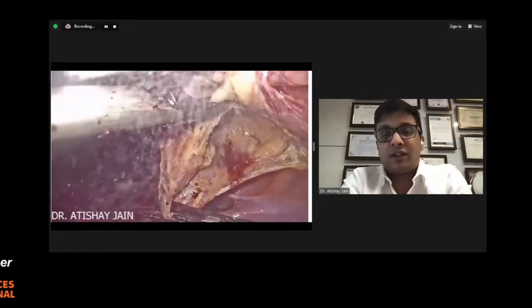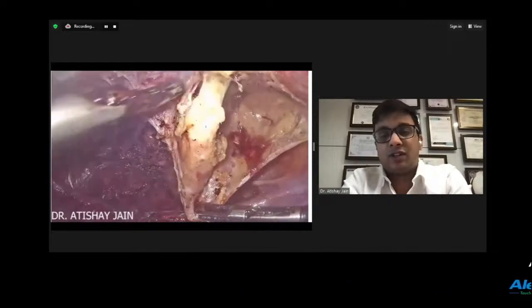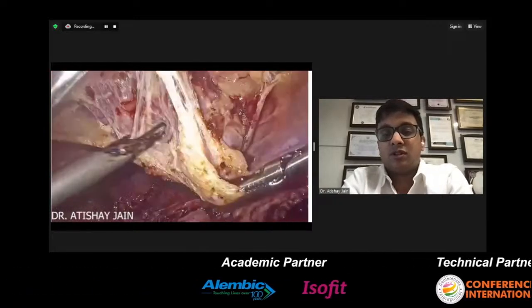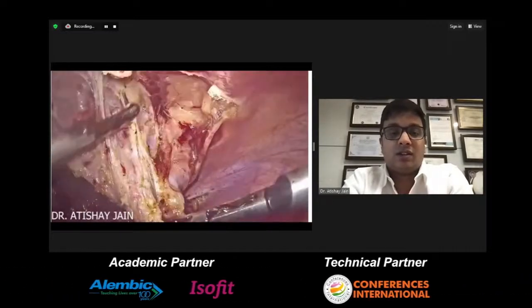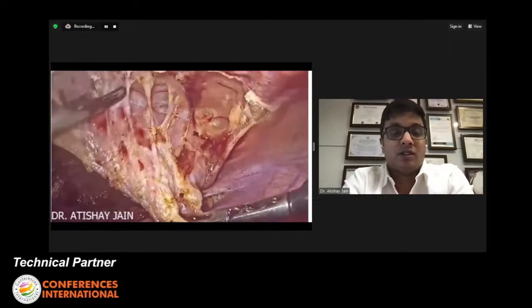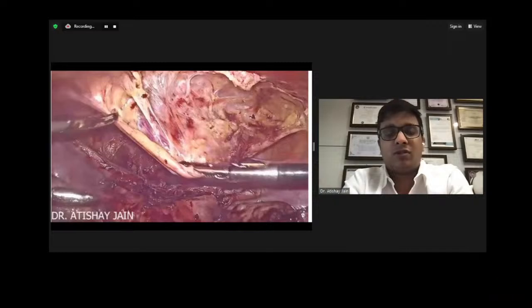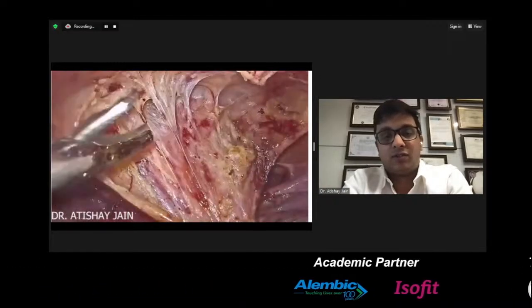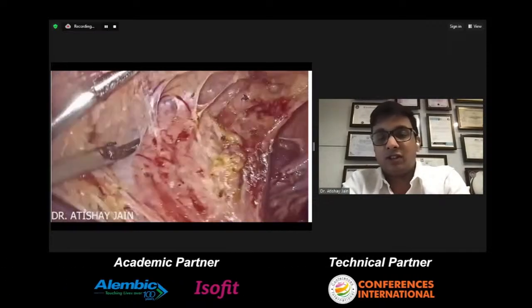Now the spaces are being created, and we've already filled up the bladder, so we know we are safe, and we are cutting above it, and we are cutting only the peritoneum and the fatty tissues. And here the fat should go towards the bladder, and as you can see, the bladder is going down, and the space is being created. Now we are not going too deep because we did not want to go for a Burch or anything. This was just a case of a bladder nodule where we excised the nodule and we sutured it, and it was in the dome, so we did not need any stenting or anything.